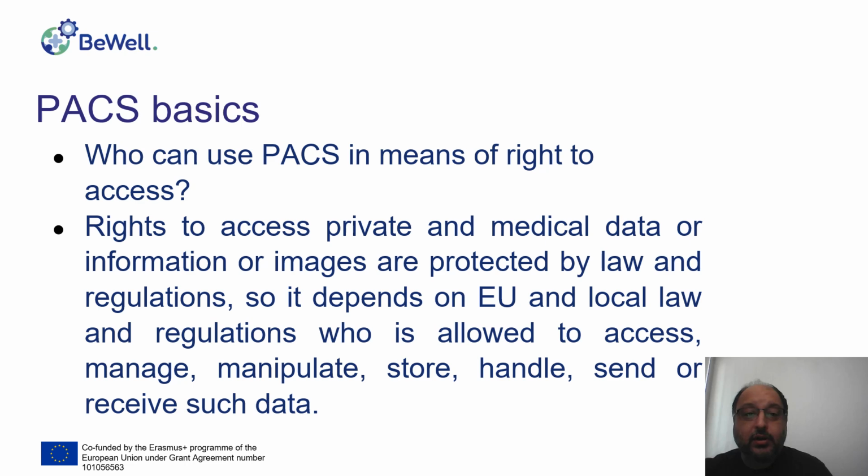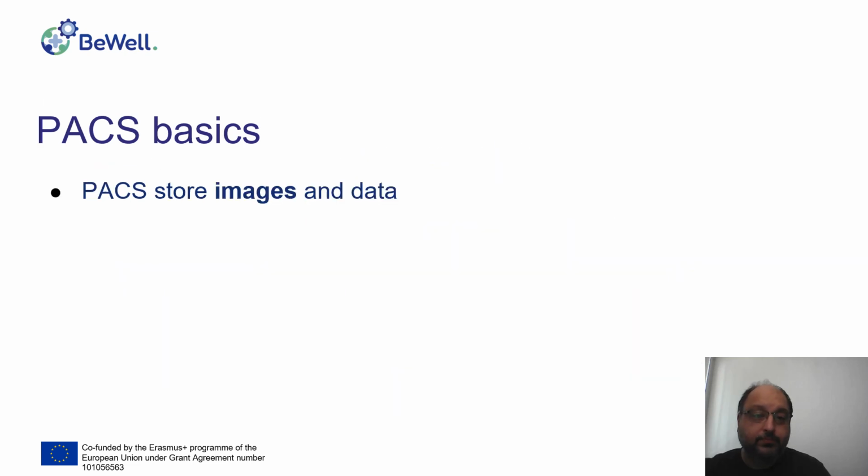Then the other question is who may have rights of access. And this is complicated because these systems contain some private data and medical data, and there are very strict regulations in the European Union about access to this data. So it depends on the laws and regulations, general EU regulations and laws, and there are some local laws sometimes that are stricter than the general EU laws. So they regulate who may access the data, who may manage or manipulate or store, and so on.